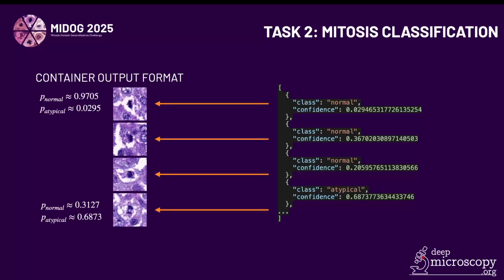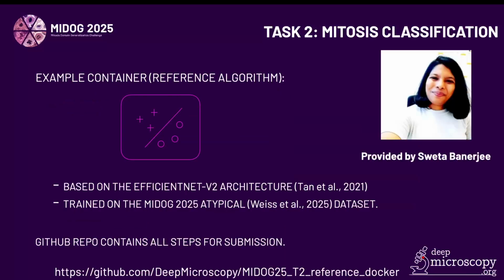This will typically be a stack of size 16, but of course not always, since the dataset size is not divisible by 16. All right, as you can also see, it's JSON format, so nothing really spectacular is happening here.